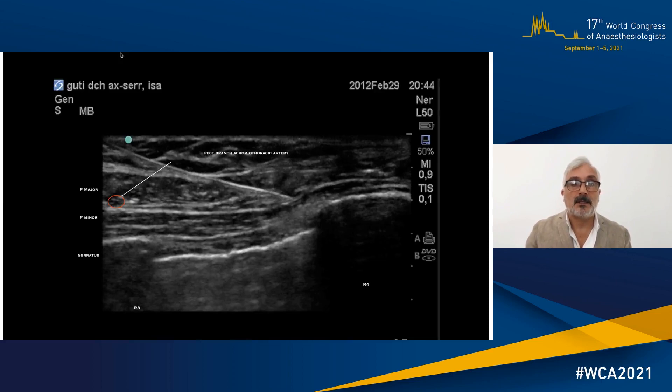Here you can see the reference I was describing: the pectoral branch — the acromiothoracic artery — with a red circle on the left-hand side. That is the fascial plane in between the pectoralis major and pectoralis minor. If you follow it to the right towards the axilla, you can see that is the main step one of my target: building up the local anesthetic in that plane. You can also see that the serratus plane block is very thin in the anterior part of the chest wall, so you need to move a bit more posterolateral.